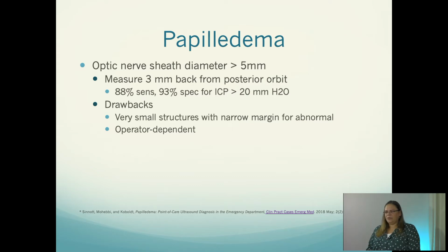And so there is a little bit of operator dependency, right? So depending on which pixel or two you choose versus what I choose, we can have a normal result for one person and abnormal for another. So there are some limitations. Make sure you take the clinical exam into play. And I wouldn't suggest that ultrasound replace other gold standard imaging techniques for diagnosis of increased intracranial pressure.